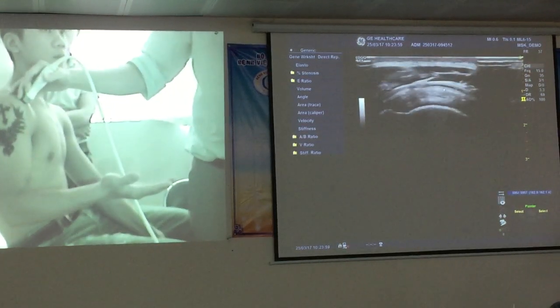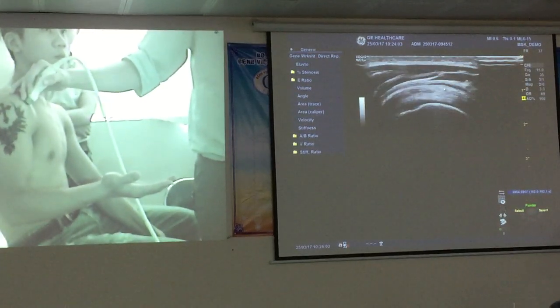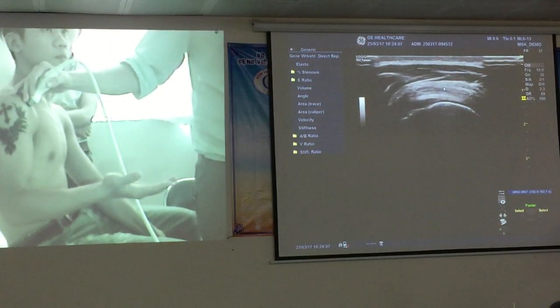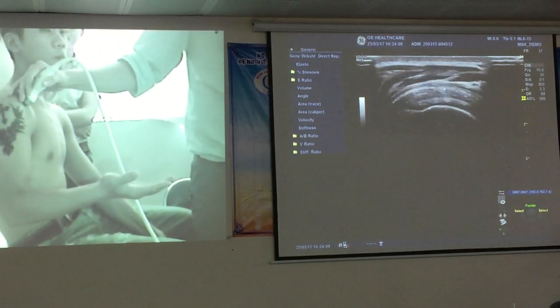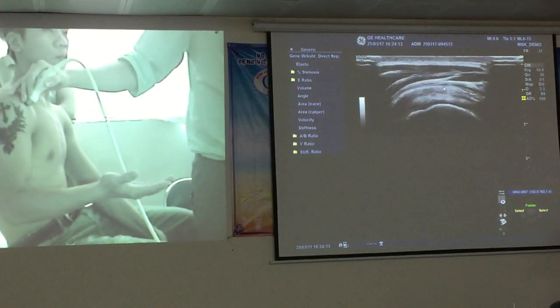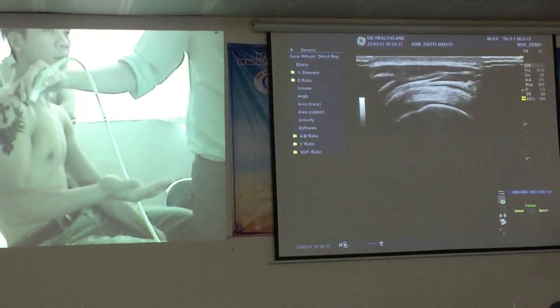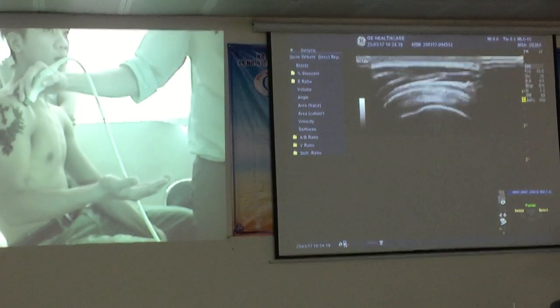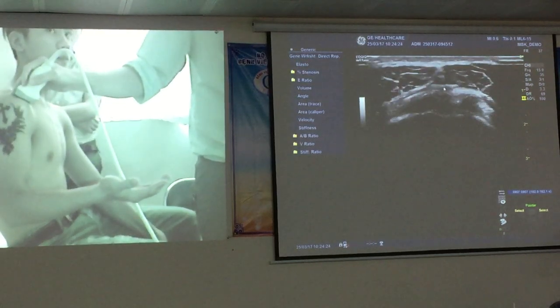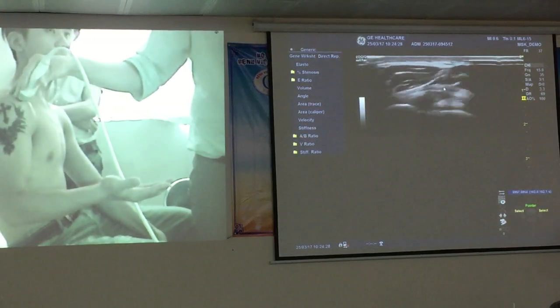So even in some patients, as I showed before, if that bursa is very thin and they still have pain when they abduct their arm, that could indicate that it's a chronic adhesive bursa. Nếu như đường dịch trong bao bọc dịch mà ít như thế này và nhưng mà bệnh nhân có triệu chứng thì mình sẽ chú ý đến là tình trạng viêm bao bọc dịch mãn tính. So very important always to refer back to clinical presentation. Phải luôn luôn là chú ý đến cái triệu chứng lâm sàng của bệnh nhân hàng kỳ khi đến khám.